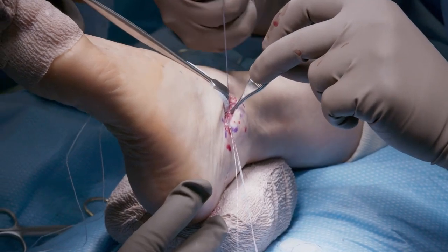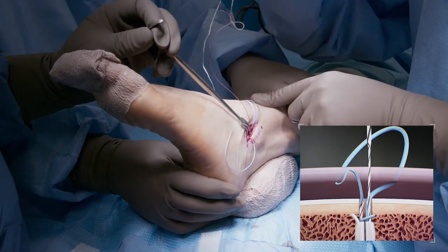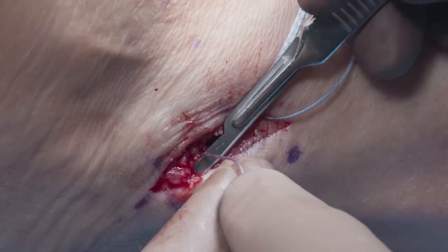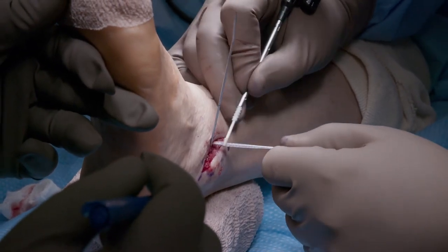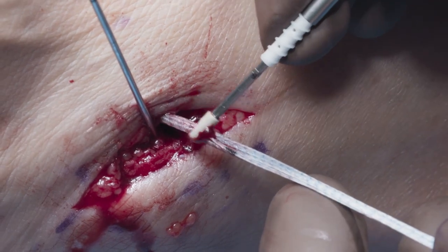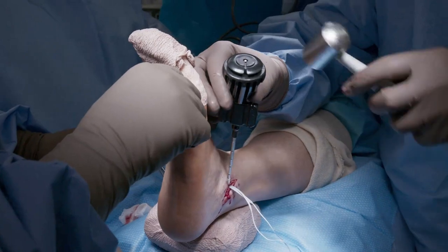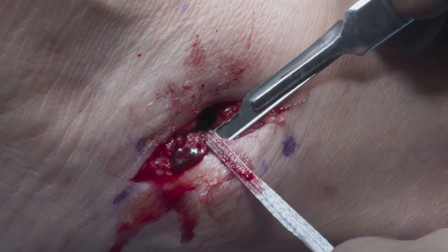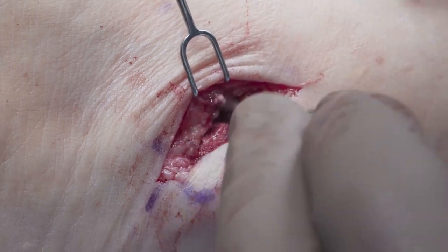Make sure the foot is in the desired position — neutral dorsiflexion and maximum eversion — and then pull the knotless tensionable technology until the desired tension is met. Cut the sutures flush. To set the position of the fiber tape, place the foot in neutral or slight plantarflexion and mark the bottom laser line on the collagen-coated fiber tape. Pull the eyelet back to the inside of the mark on the fiber tape and implant the 3.5 mm swivel lock, completing the internal brace ligament augmentation. Cut the remaining fiber tape. The inferior retinaculum is finally mobilized and sewn over the repair.